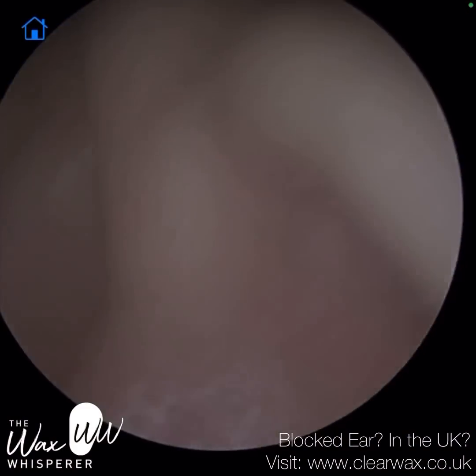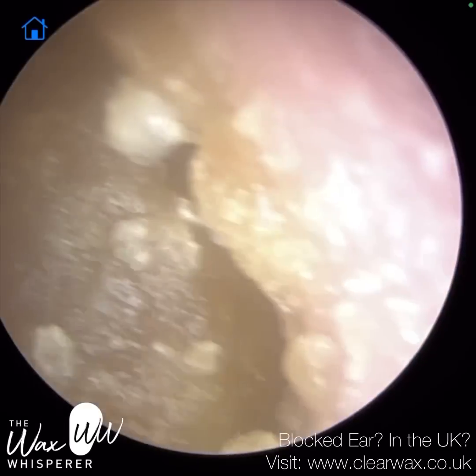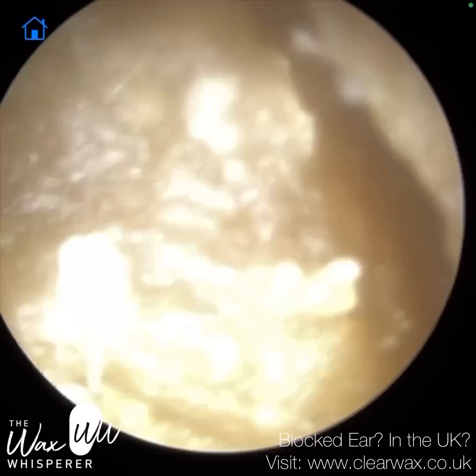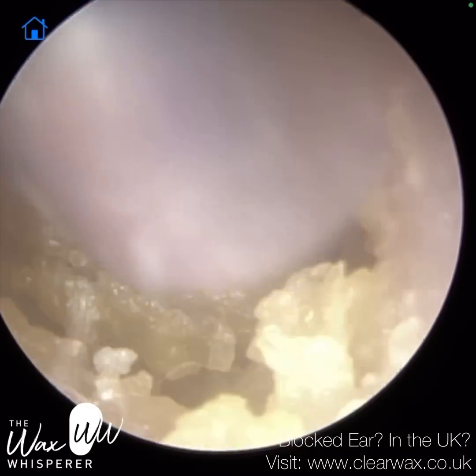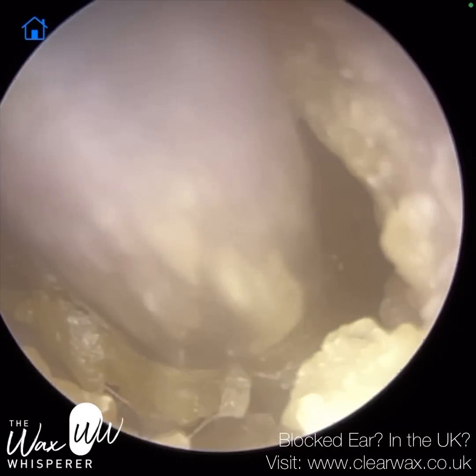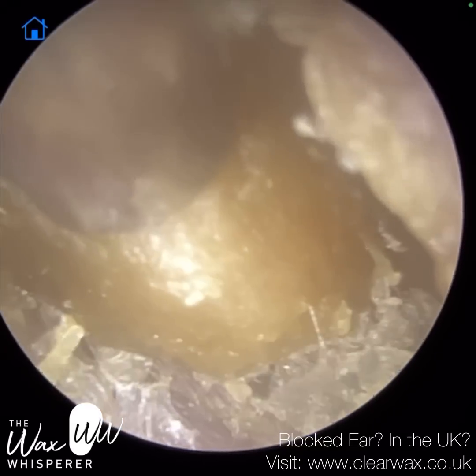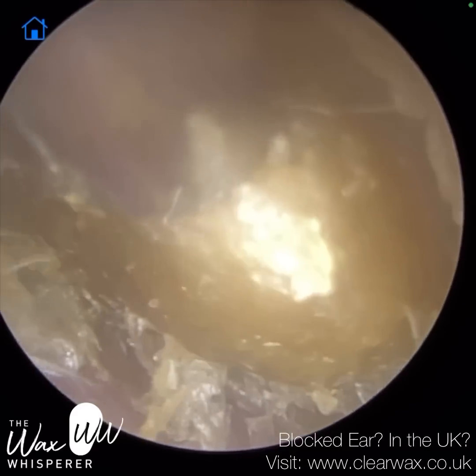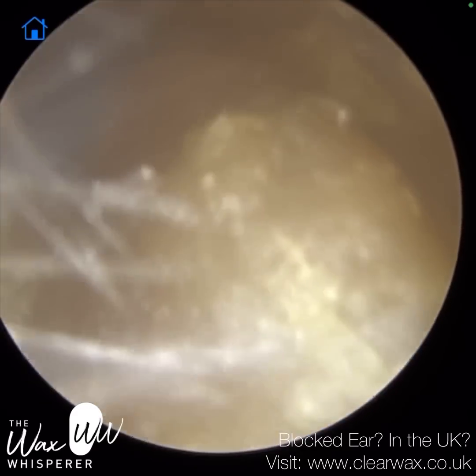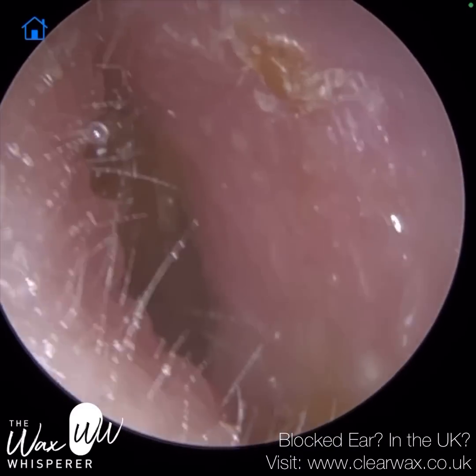Just zooming back out. Same patient, now with the right ear — I've gone back to the standard view. Because this wax is near the entrance, you don't need to zoom at the moment. This is a lot drier and firmer — this is the ear where they haven't been using any drops. I'm just trying to lift it off the floor of the ear canal, and you can see all those skin adhesions. That skin is not only enveloped and attached itself to this wax and skin plug, but it's also still adhered to the ear canal wall.